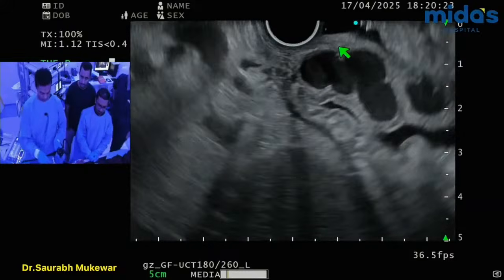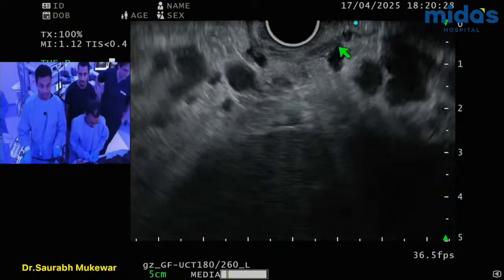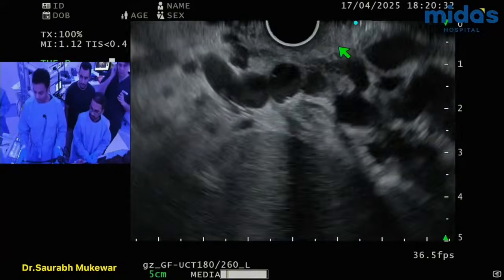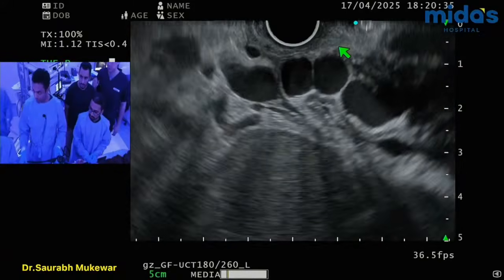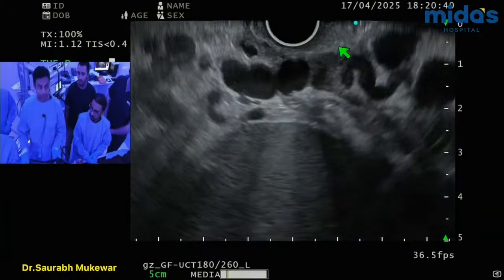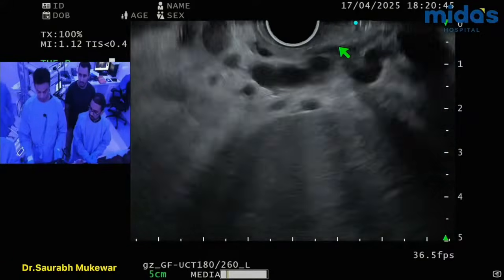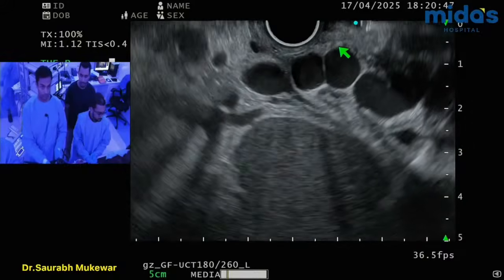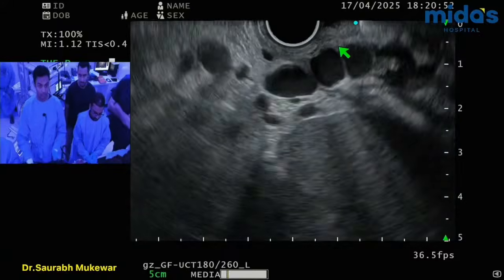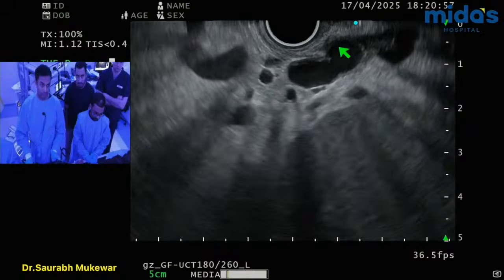Do you have an NS flush ready? Is everything okay? So this is sort of the site to go.